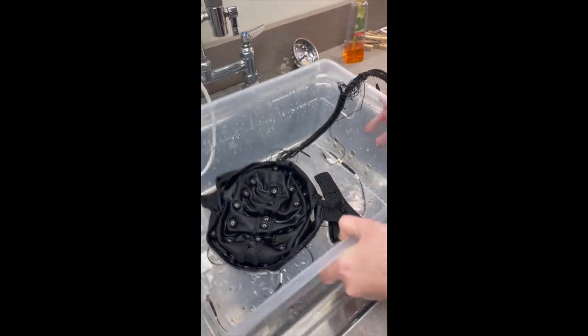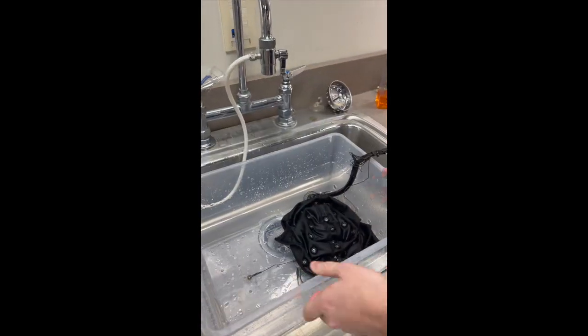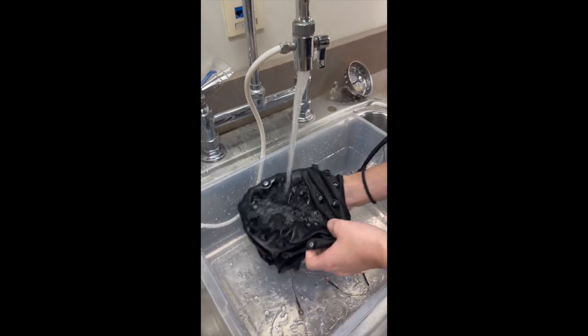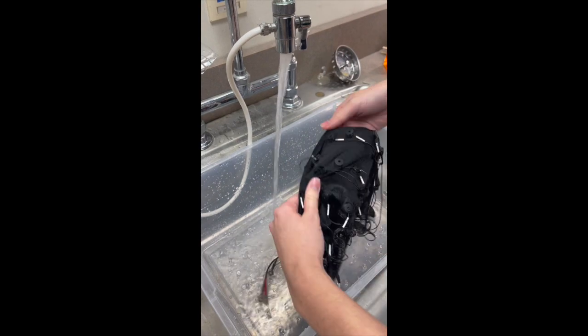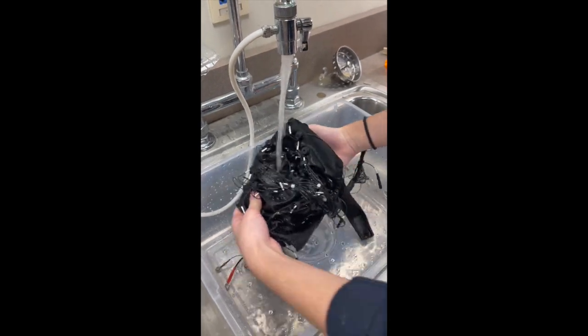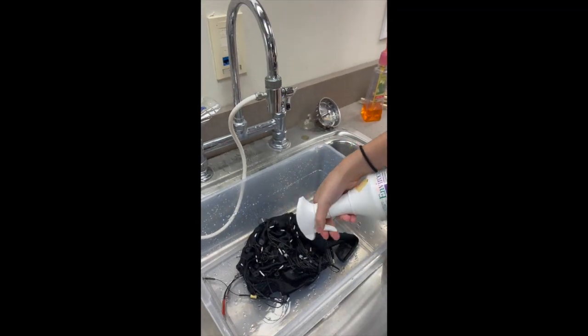Drain the sink of the soapy water, then tilt the wash tub to the right to drain the water from it, being careful not to let any electrodes get snagged. Then rinse the cap in the wash tub with clean running water, making sure to get the ocular electrodes as well.